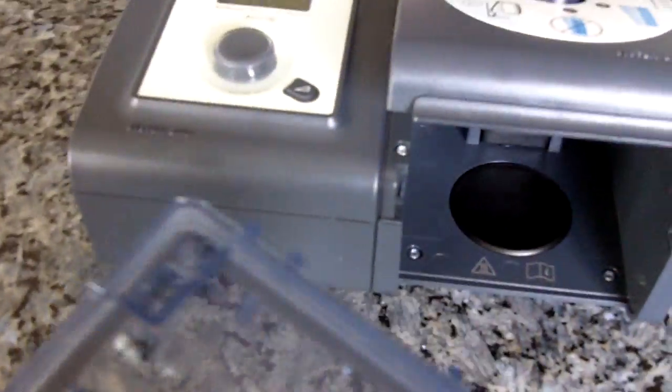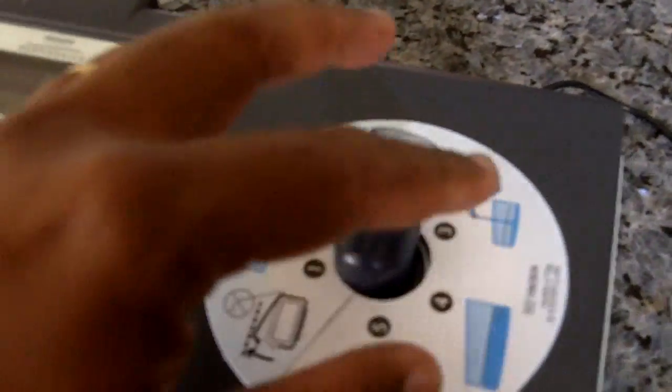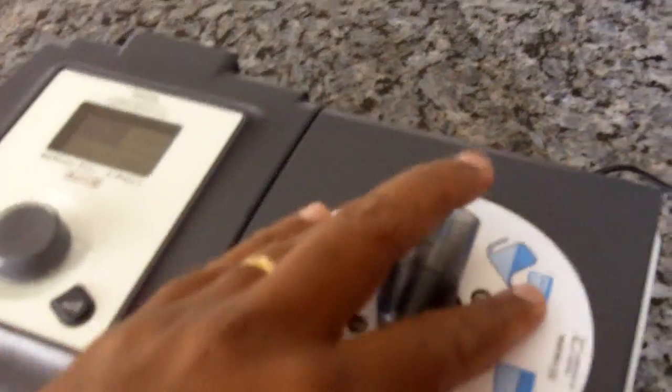But let me answer your question more specifically. Yes, the System One heated humidifier by Philips Respironics, yes, you can preheat it, and yes, it has sensors outside here that can monitor ambient humidity level and temperature.